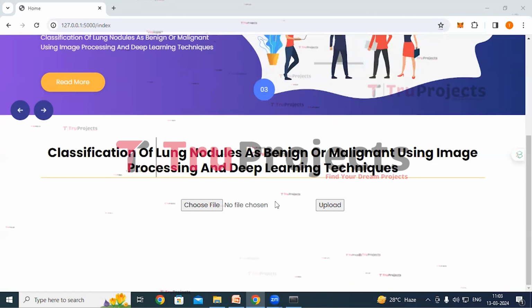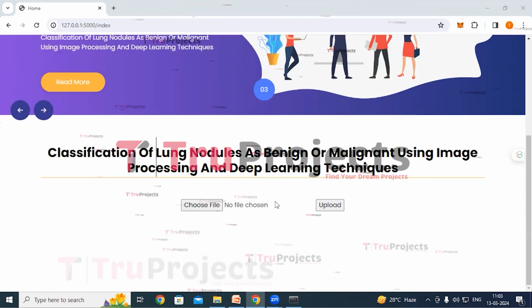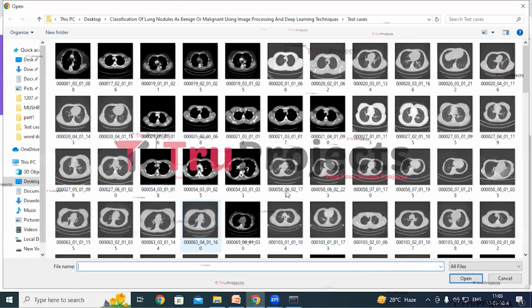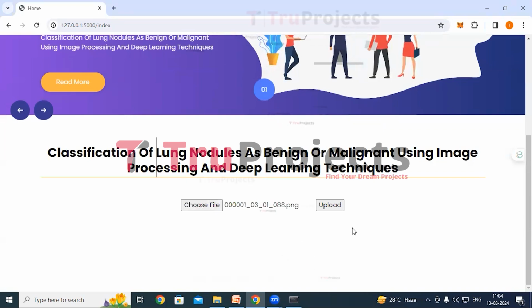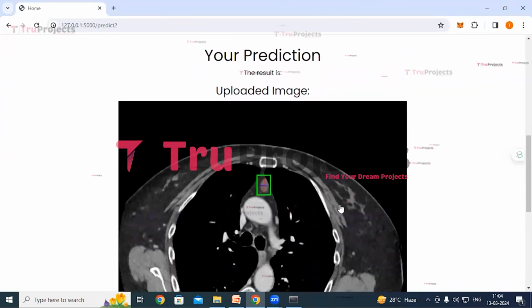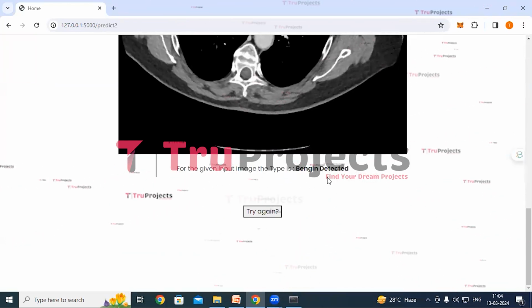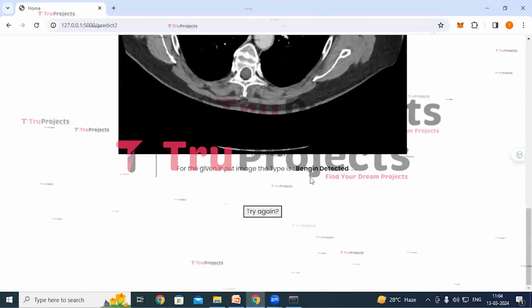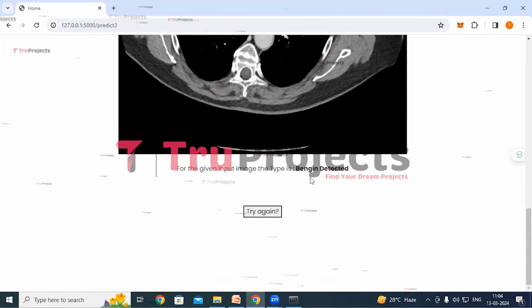So now we have to upload any radiological image here, and the application will classify the lung nodule as benign or malignant or normal from the image. Click on choose file button. So these are the test cases I have. I'm selecting the first case and click on open. The image is loaded. Now click on upload button. So this is the uploaded radiological image, and here we can see the classification that is benign. So benign means the lung nodule is not cancerous but could grow slowly.